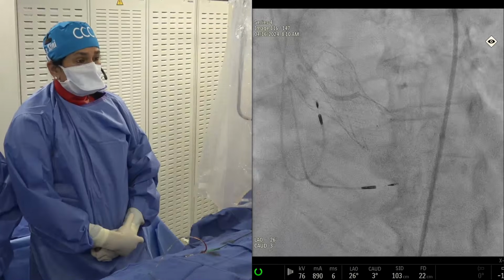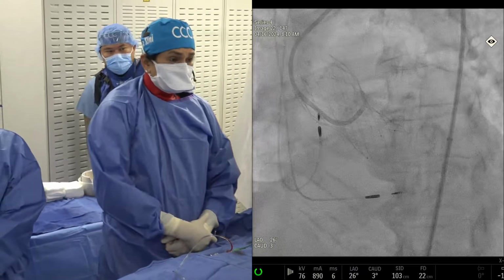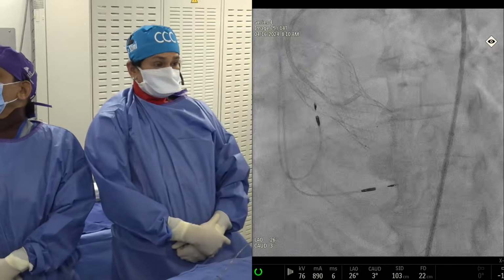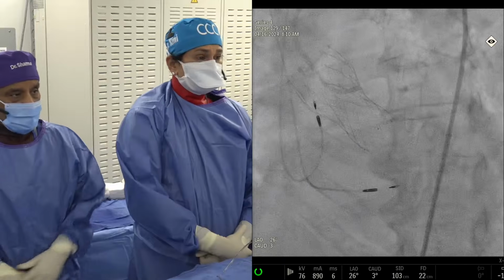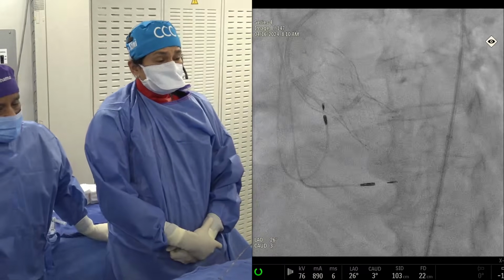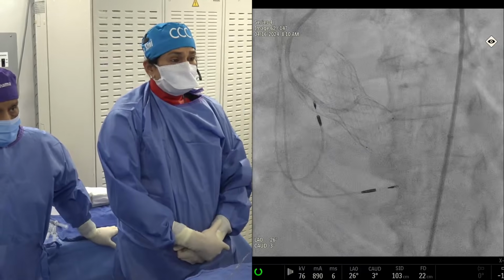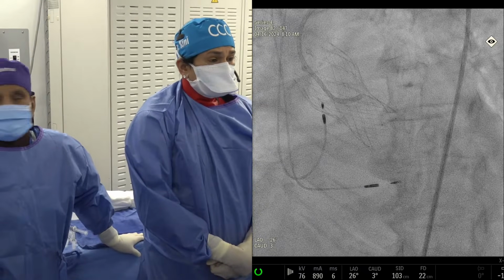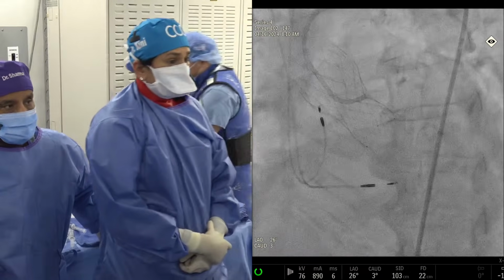Now you have to see the diamond, so we will show you the 3D picture. Yeah. So can we show that animation that we have created? They can show the animation also. This is 3.5 or 4? This is 3.5. Yeah. So always half size lower. Yeah. And fit in nicely. So you see that there's a non-selective picture to understand exactly where the left main is coming off. Then you have to go counterclockwise, so you will find the right diamond.